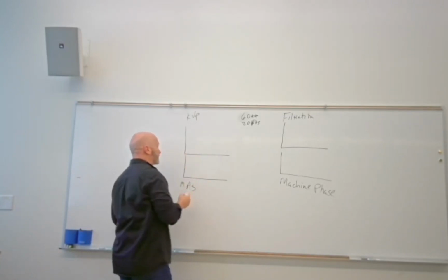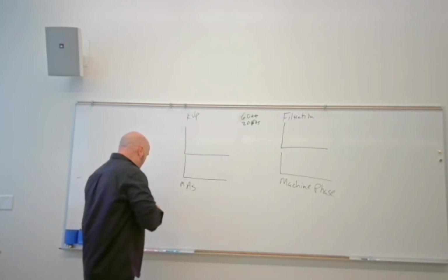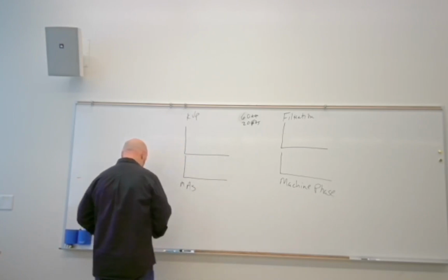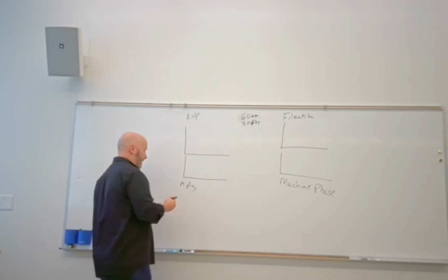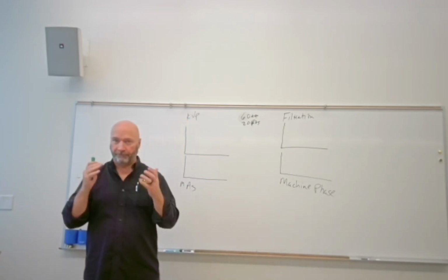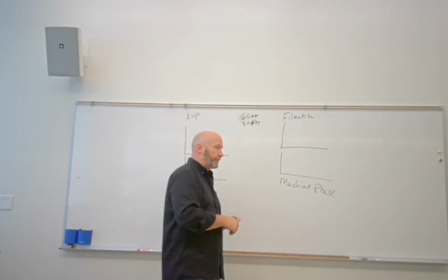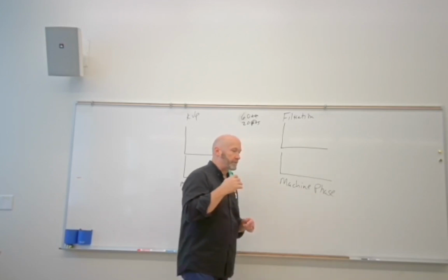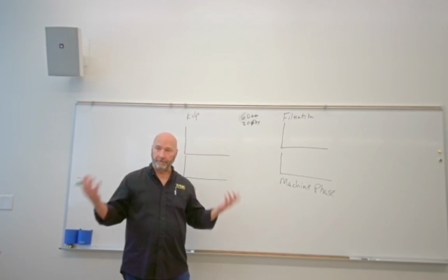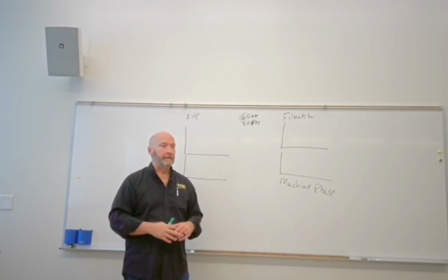Okay, so we've got a Brems spectrum, and let's start actually with the green, because it'll stand out a little better. So at the face of your anode, your emission from the anode is isotropic, goes off in all different directions with equal intensity, right?